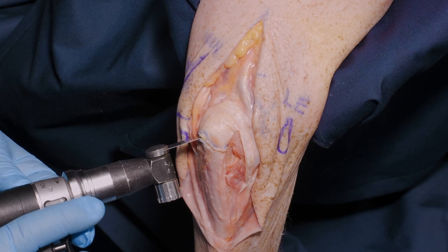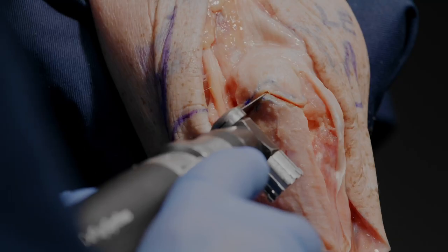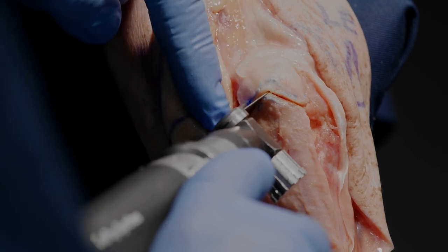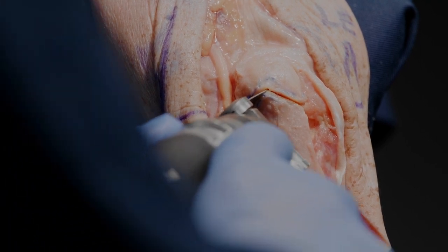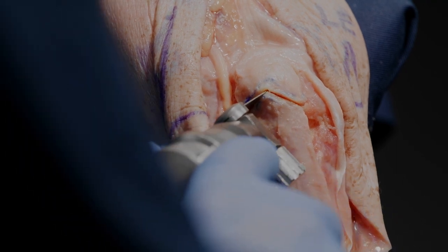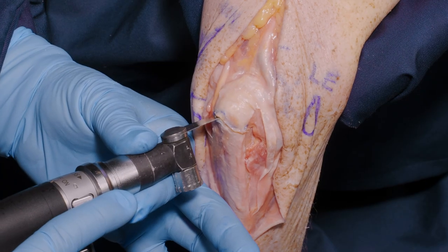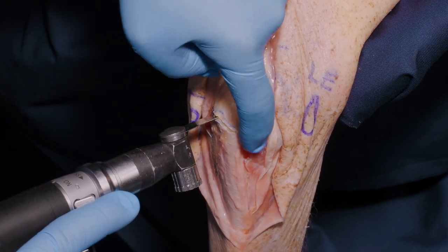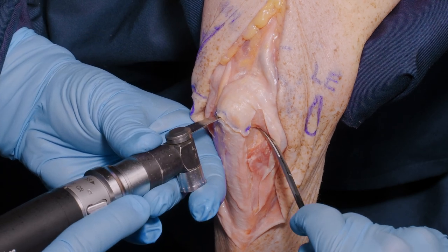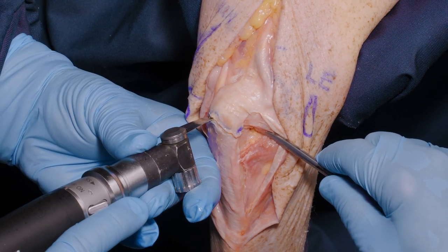Here we are performing the chevron osteotomy apex proximally. The depth of the bone is greatest in the center of the ulna, not at its margins. So the angle of the saw must be adjusted so as not to damage the distal humerus. We gradually take the osteotomy and rotate the saw so that we're no longer cutting into the more shallow areas of bone either side. We do not go all the way through the bone with the saw.